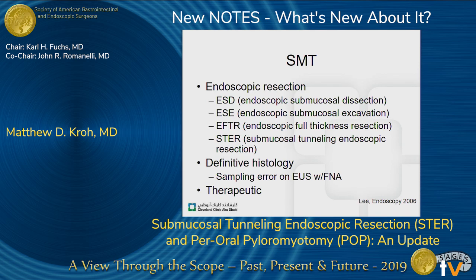So what are the advantages of these? Well, it's very similar to what our surgical specimens are. It allows us to generate definitive histology for these otherwise sometimes challenging submucosal tumors. There is a potential sampling error on EUS with FNA, and obviously it's therapeutic as well for patients who want these lesions removed.